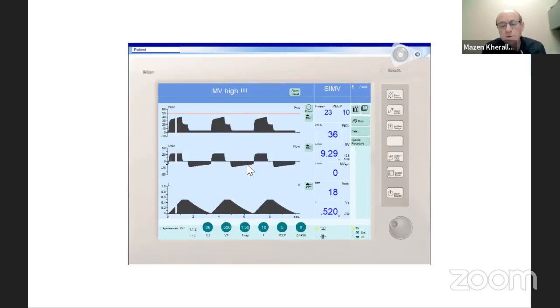How are you going to solve the problem of the patient? The patient's saturation, by the way, was 97%, and on the ABG his PCO2 was 44 millimeters of mercury and the pH is 7.36. So what's your approach to manage the ventilator for this patient and improve the dynamic hyperinflation syndrome?